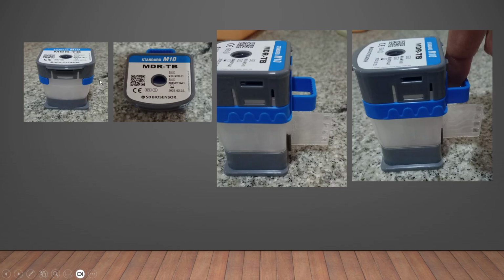So this is the cartridge. Now this is how it looks. It has a protection here. As you can see, this plastic item that is present is the protection. When this is present, the cartridge can be tilted and moved, all these things can be done, because the individual components present inside the cartridge will not get mixed, since they are all in a sealed position.